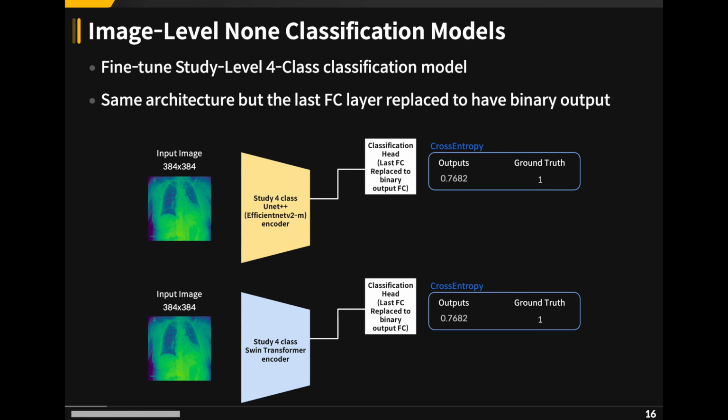To prevent potential leaks, we used the same validation splits used when training the four-class classification models.